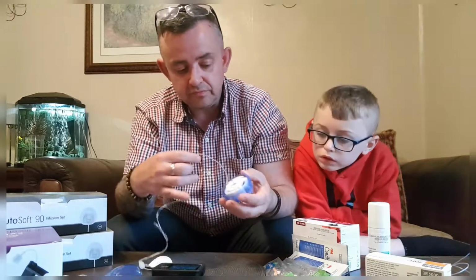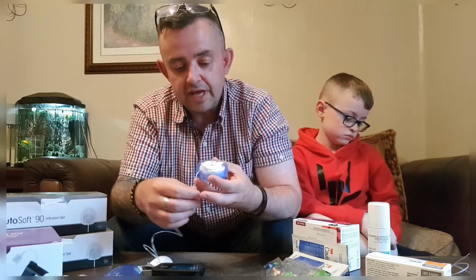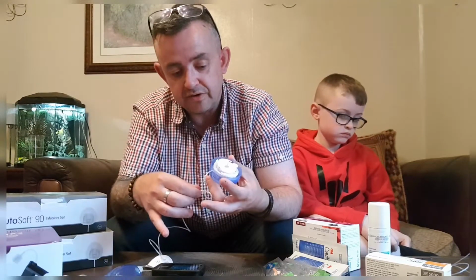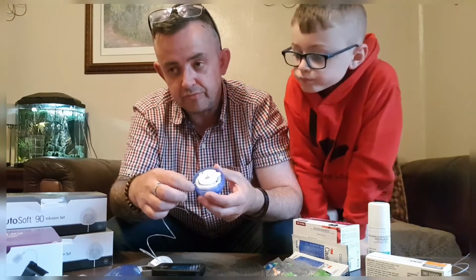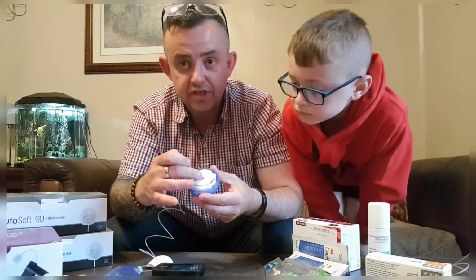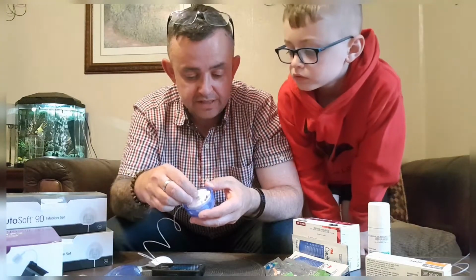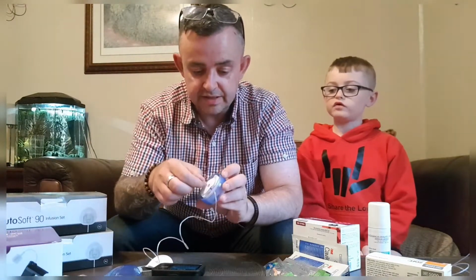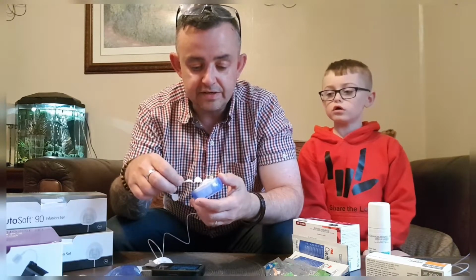There's a little cut out there for the tubing that sits in there. Now you mustn't pull that down. My Tandem trainer Katie taught me this. If you pull this down, it'll break. There's a little sheath on top of the needle, which is part of this tubing. Don't touch that, because if you pull that, it messes with this sheath on the needle, and then it doesn't work properly. I'm going to take off the protective needle cover, and then I take this off, which is just the plaster cover to make it safe around it.